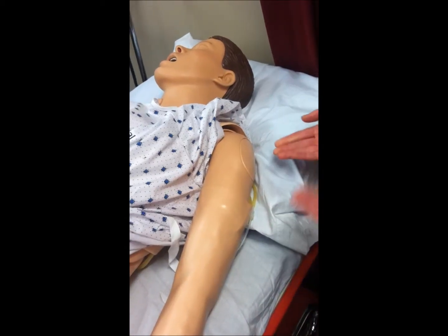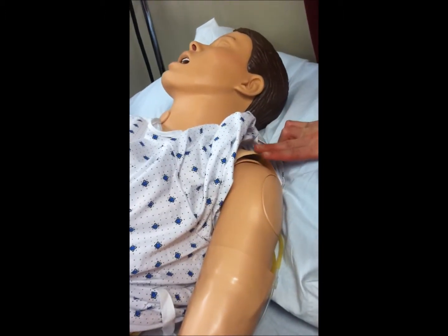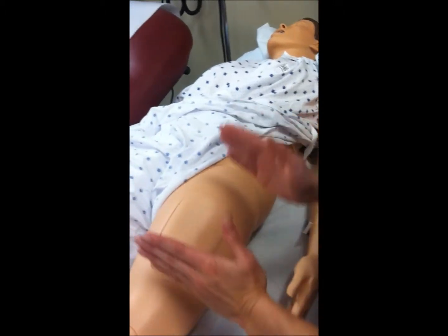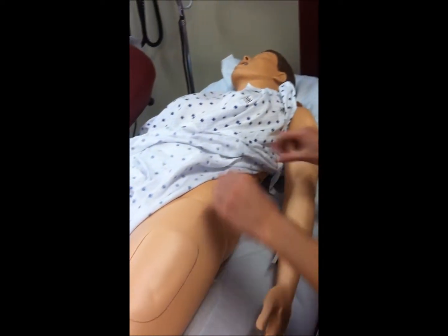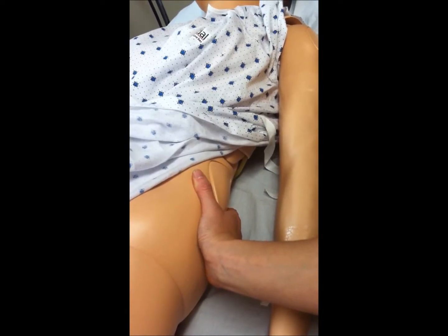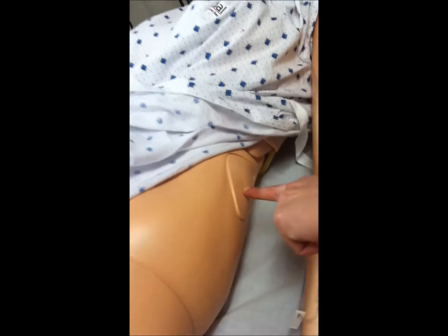For injections, it is important to landmark the site. For the deltoid, landmark the acromion process and inject 1 to 2 finger breadths below. For the vastus lateralis, inject in the middle third of the thigh, between the greater trochanter. For the ventrogluteal site, place your palm over the greater trochanter and form a V, with the middle finger toward the iliac crest and the index finger toward the anterior superior iliac spine, and inject within the center of the V. Needles are similar to the elderly population in terms of site and technique.